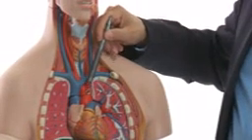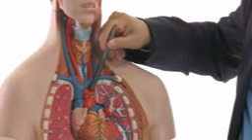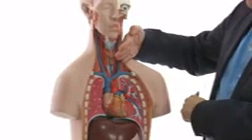Why are we imaging the aorta from here? Well, I have to show you if I take away his lungs. So from up here, we'll be seeing the aorta. And we'll want to see how the flow is actually in the descending part of it and in the aortic arch. Yes, the transducer, you have to remember, has to stay parallel to the vessel, and the marker will point up. So this is about the orientation you have, because remember the ascending aorta goes to the right, and then it curves down and caudally to the left. So this is about the orientation you have to have.